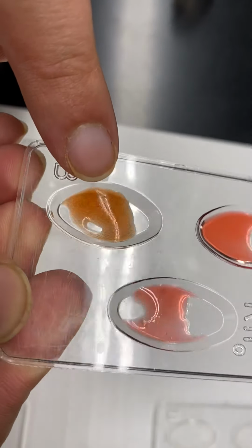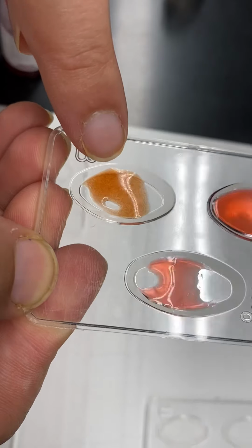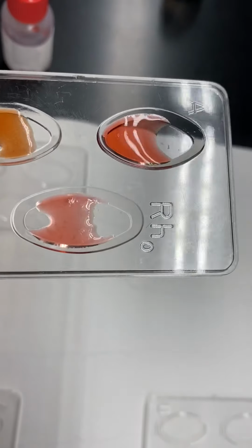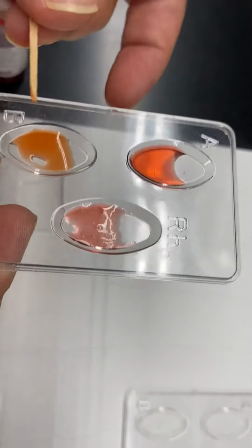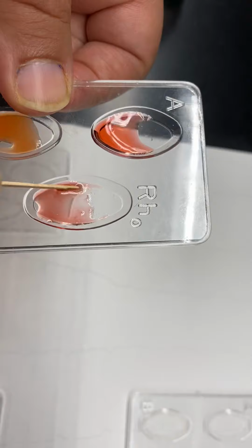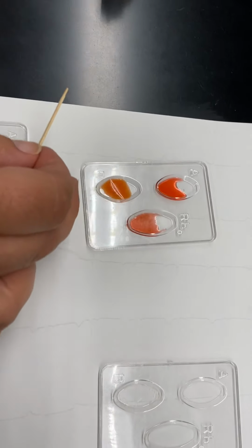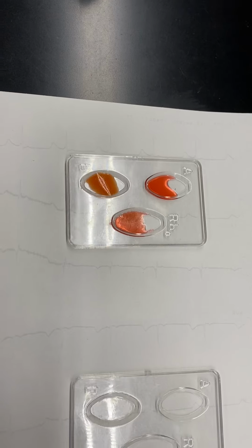You see there's a lot of bumps in there, little circles in there. This means that there is a reaction in this one. So that's identified as clumping or agglutination. And actually, if I'm honest, you also see a reaction in this one. Again, notice how the clearness has gone away, and now you see a lot of structures forming in here. So this is also identified as a reaction.